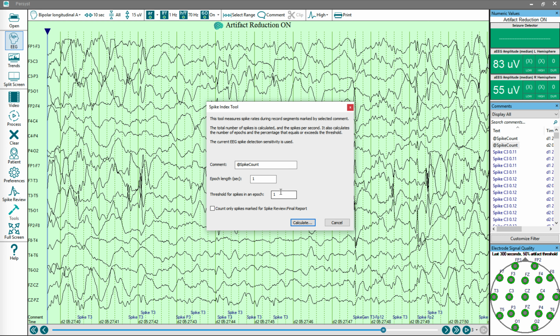Tradition is, people would take 10 or usually 30-second epochs, they would page through and look at it and visually just say, is this epoch true for continuous spike wave? And they would say, well, it is true. And then they would page forward and say, well, this 30-second epoch is not true. But the variability in the spike rate in each one of those big epochs might change from human to human as far as what they would call it. And so using shorter epochs helps to get around that. It makes it a bit more granular, and your definition is something you can pretty much agree on.